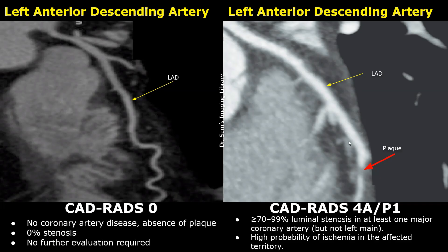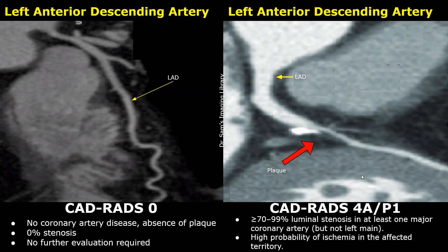This plaque is somewhat subtle but seems to be causing a severe stenosis that almost includes the entire lumen. It was graded as CADRADS-4A P1. This plaque has a mixed density — almost half of it is calcified and the other half is non-calcified and hypodense. The stenosis is severe; almost the entire lumen is stenosed. This was classified as CADRADS-4A P1.